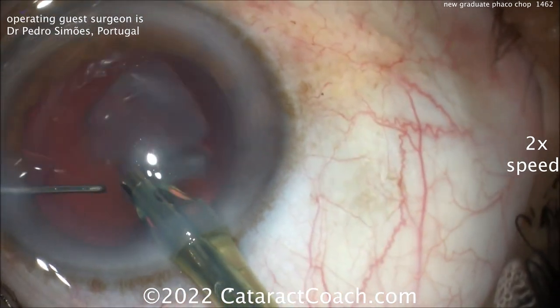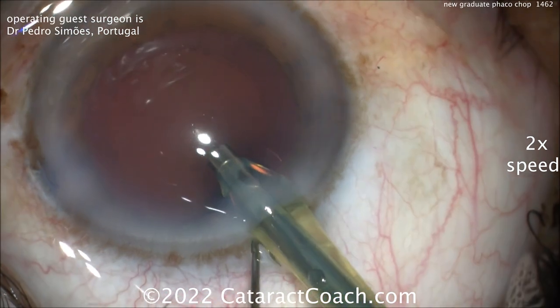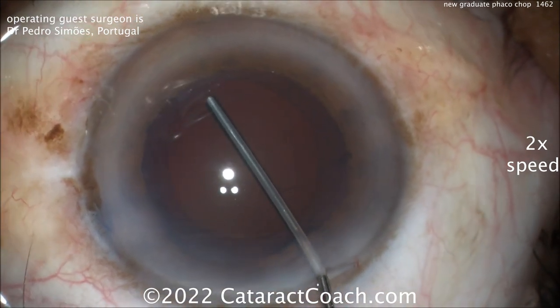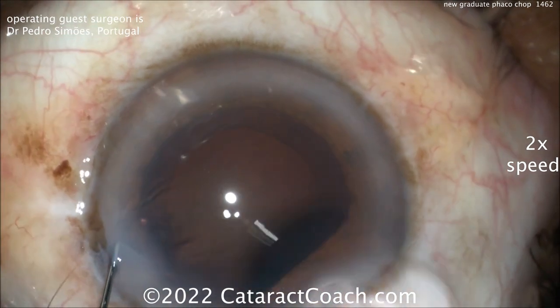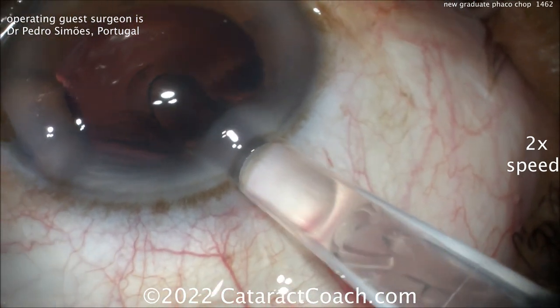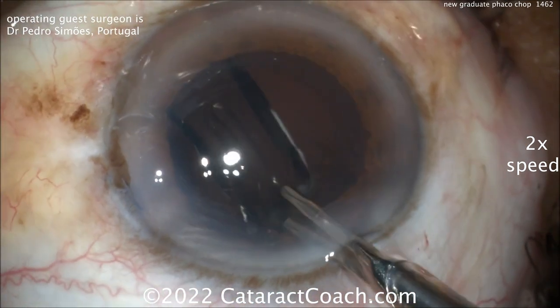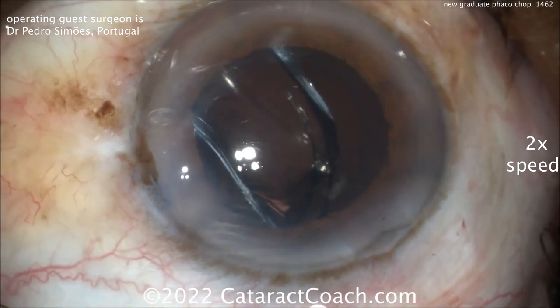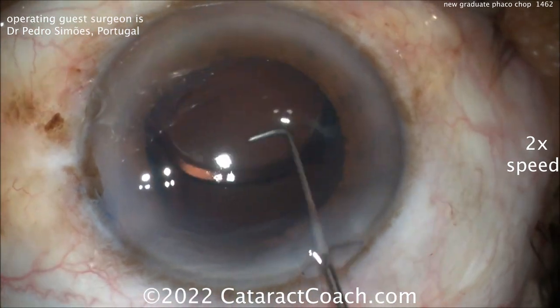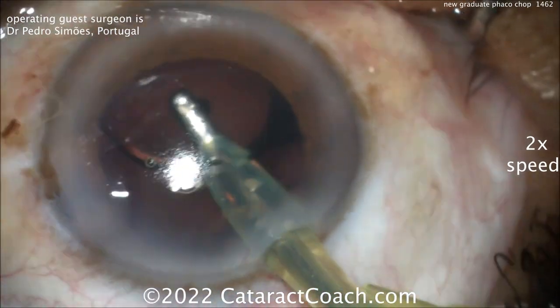To learn Faco Chop during your surgical training — wow, that's fantastic. If you're a recent graduate and you're already doing Faco Chop, I'm already impressed. For reference, in our program at UCLA historically, out of the eight residents trained per year, one or two could learn Faco Chop during residency. The others were very good at Divide and Conquer or Stop and Chop. So about 25% of our graduates from a pretty good program could learn this during residency training. The rest would have to pick it up a little bit later in their careers after the culmination of training or residency.